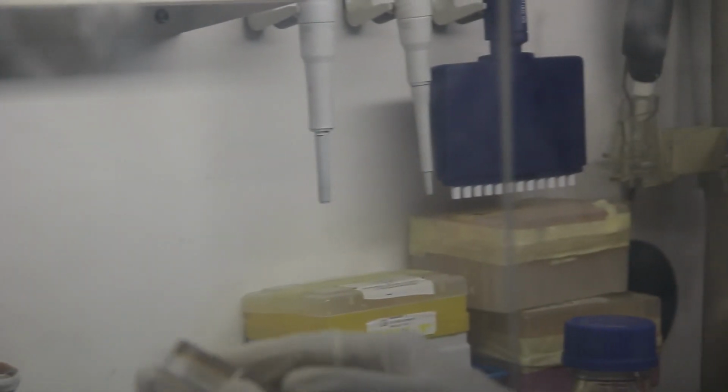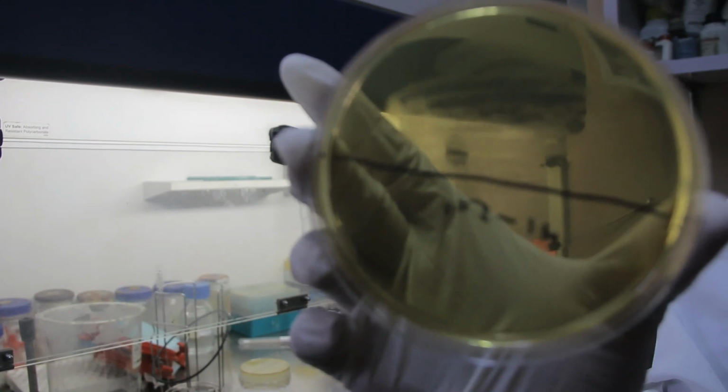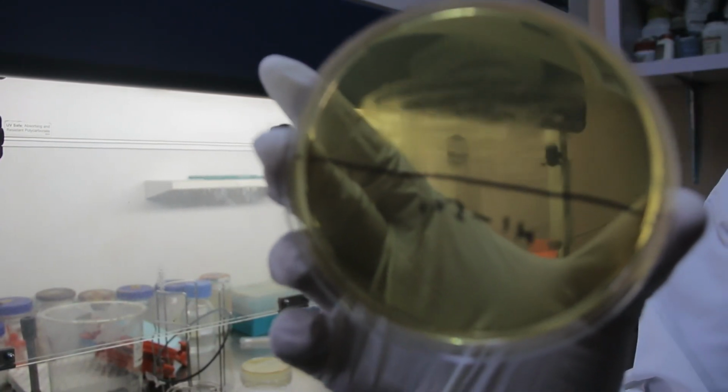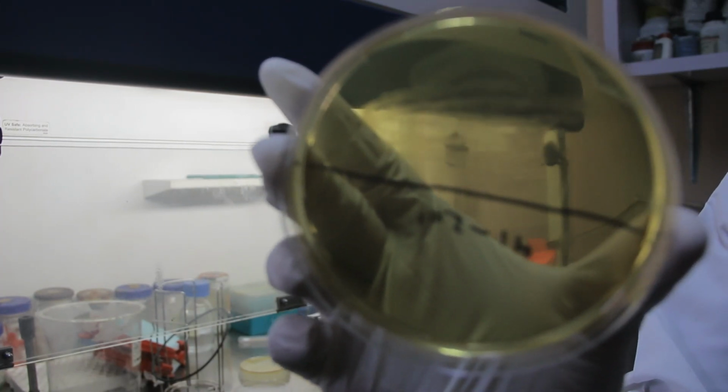For visibility's sake, I'm going to bring the plate closer to the camera. These are cultures from the antrum and corpus of patients from the endoscopic procedure.